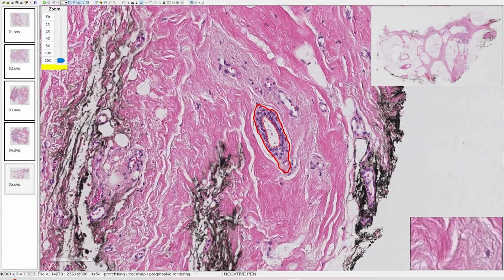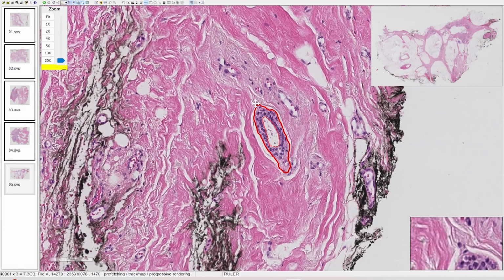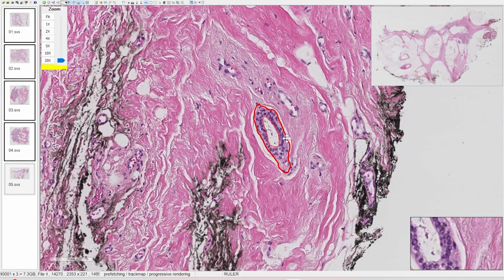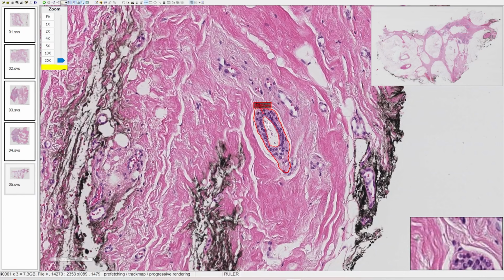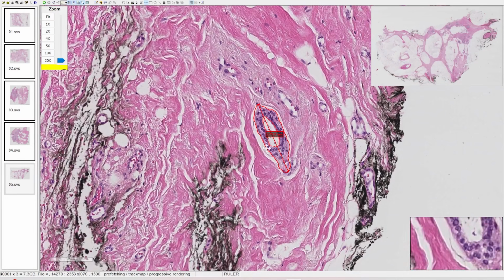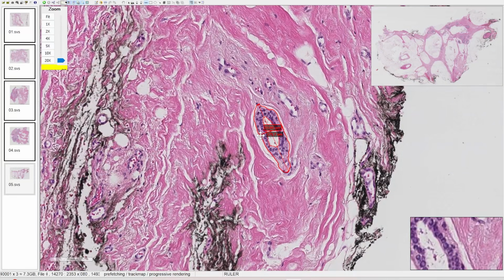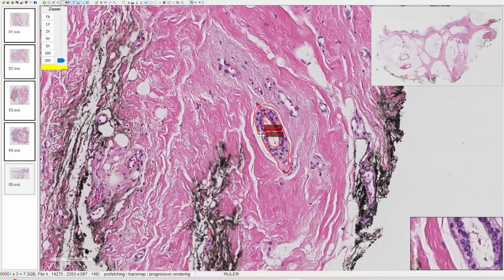You can also use the ruler tool to measure the distances if you need by pressing on F4 or function 4, or use the ruler tool from here. Let's simply measure the height and width by clicking on a point and grabbing that line to another point. It will measure the length. It's about 175 micrometers in height, and also the width for that will be about 56 micrometer.